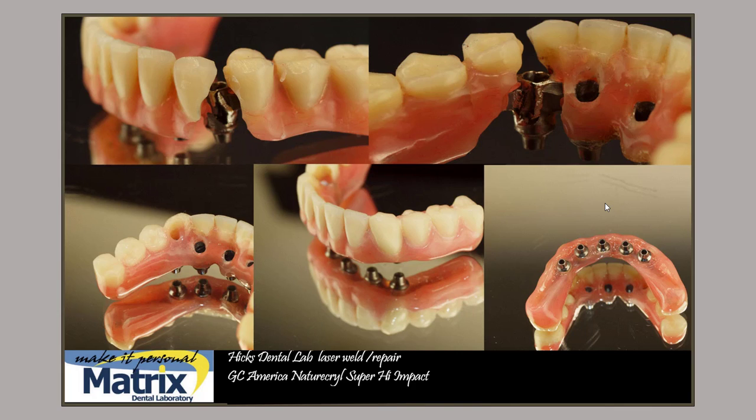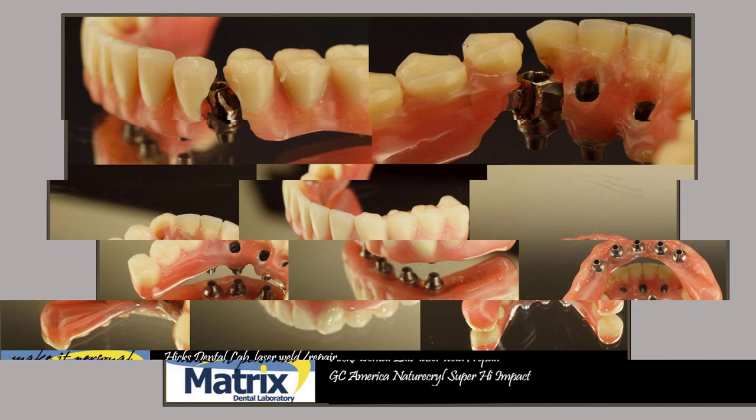Anyways, I want to thank you for stopping by today. Take a look at this video. I hope you got some ideas on repairs. Maybe one or two little things that I've done that maybe help you through your next repair.